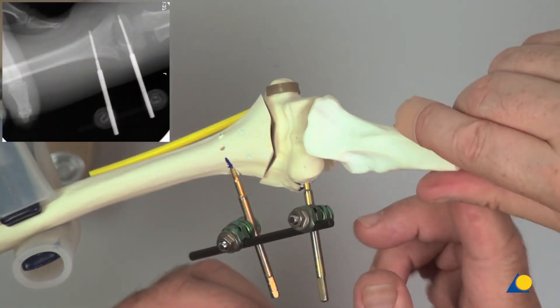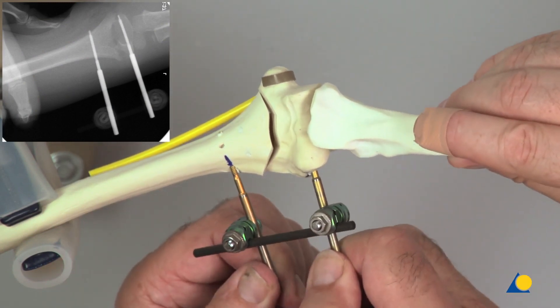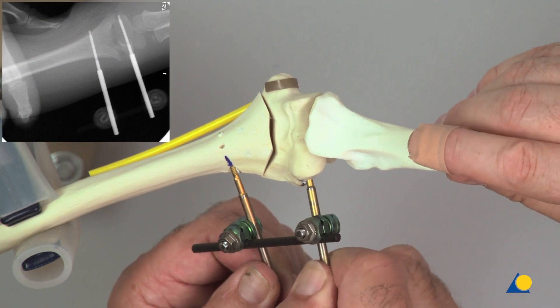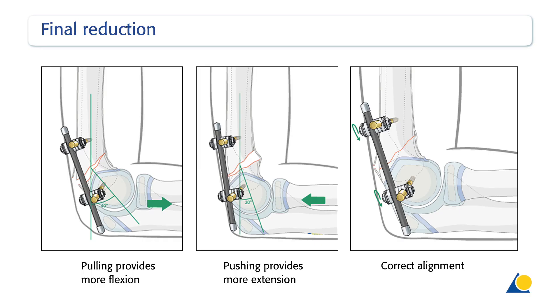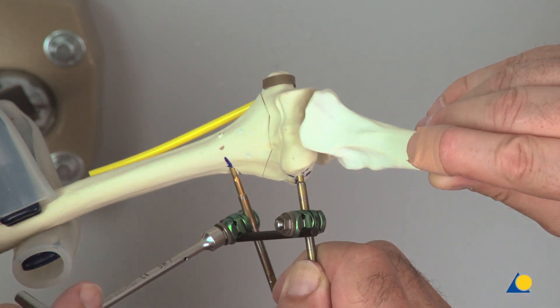With the proximal fragment in a true AP view, the distal fragment is manipulated until a satisfactory orientation is obtained. With the upper arm held firmly and the elbow at 90 degrees, pulling along the axis of the forearm causes flexion and pushing causes extension of the distal fragment. Using these manoeuvres, a correct alignment can be achieved. Once the reduction is achieved, the clamps are fully tightened.